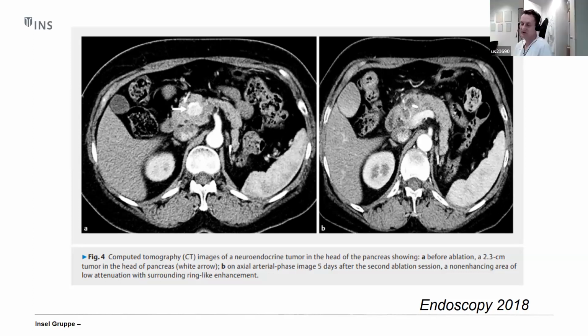Wie schaut es mit der Nachkontrolle aus bei den zystischen Veränderungen, die ich dann verbrannt habe? Wenn ich nichts tue, habe ich ein schönes Bild und kann schauen, ob Knoten wachsen. Wenn ich jetzt eine RFA habe, die inkomplett ist, habe ich da nicht ein Problem, die Noduli noch zu sehen? Im Prinzip ist nach wie vor die Bildgebung mit einer MR der Goldstandard für solche Läsionen.